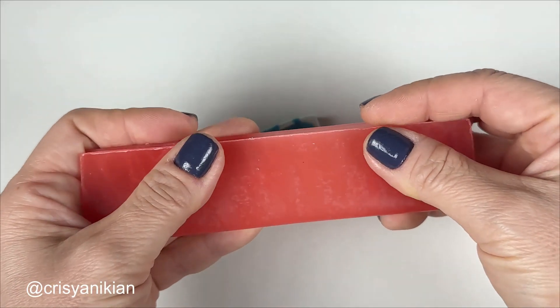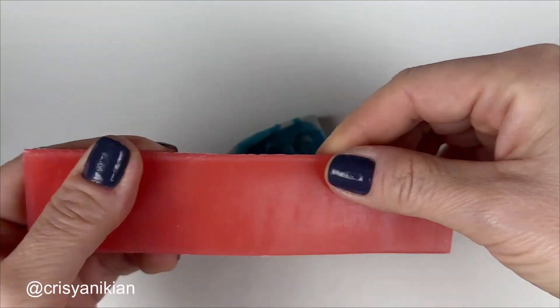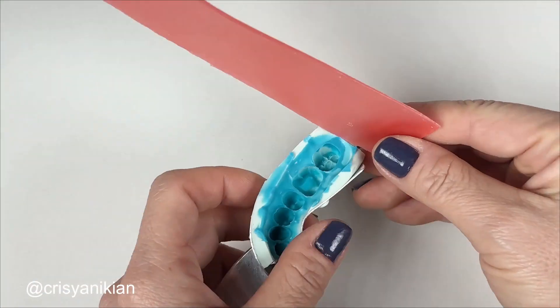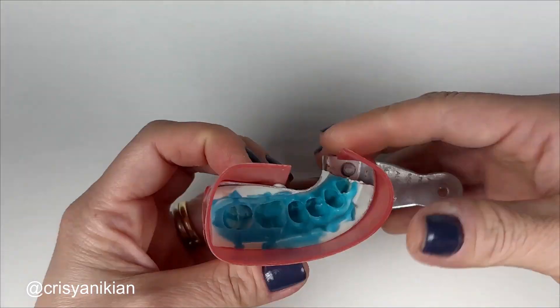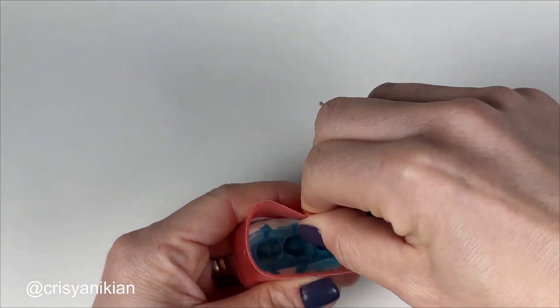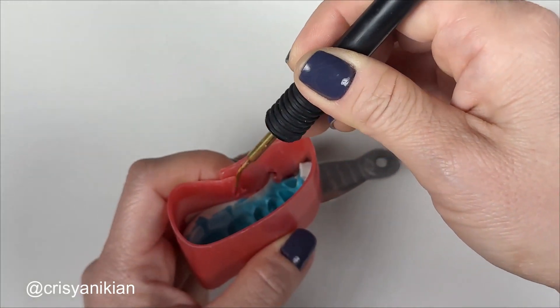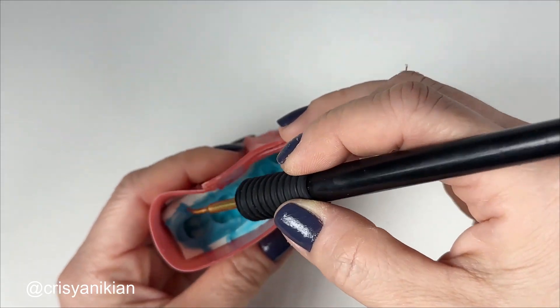You can also use a number seven wax plate to make this barrier. Cut the wax plate in half and wrap it around the mold. Use the dropper to plasticize the wax and apply it at the interface with the mold to join it properly.